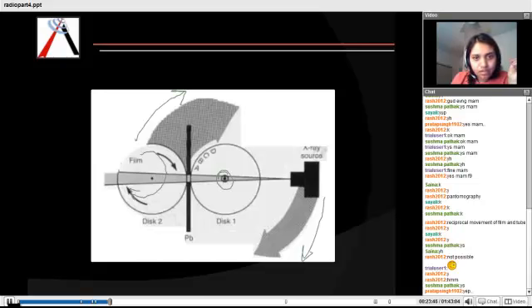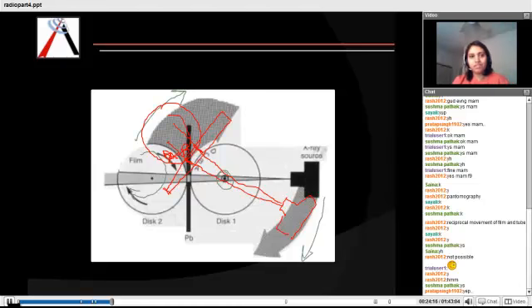Okay. Our object is stationary, our slit goes here along with this. And our X-ray tube now comes here, and our disc will come here. But not only that, the disc will rotate here so that A moves here and B comes in front. I mean, B's position comes in front. Getting the point? So ultimately we are getting the same effect without moving the patient.